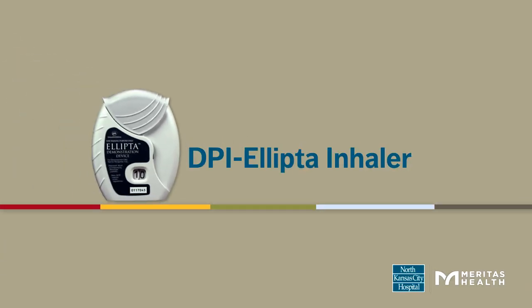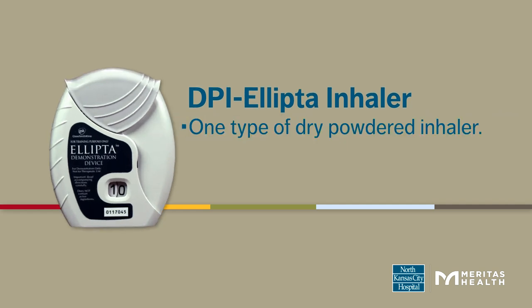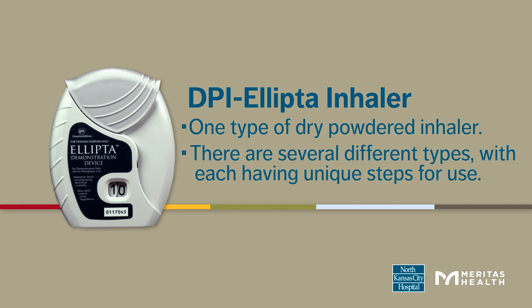This video will walk you through how to use a dry powdered Ellipta inhaler. An Ellipta inhaler is one type of dry powdered inhaler. There are several different types, with each having unique steps for use.